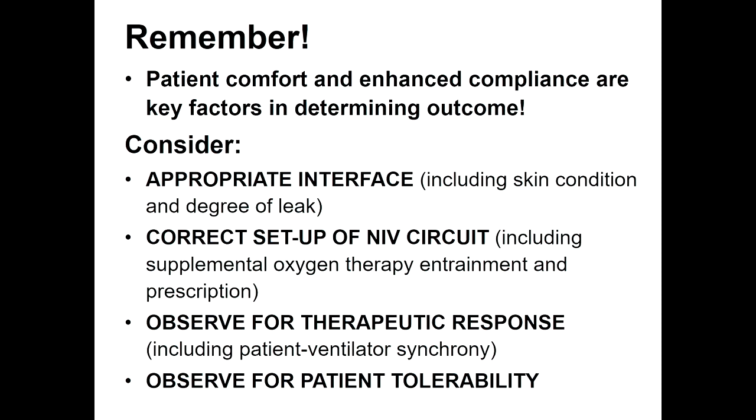We would encourage that you consider that you have got the appropriate interface and that it is well fitting. We would encourage that you frequently review the NIV circuit, making sure it's the correct setup, paying particular attention to what we have said about the different setup with patients with suspected or confirmed COVID-19.